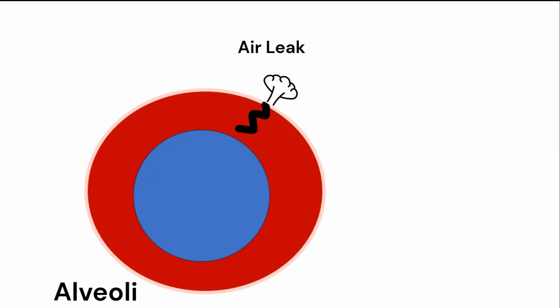The gas pattern is also useful in patients with air leaks. Since the high-speed gas stream is traveling through the center of the airway, it bypasses any areas of air leaks. This prevents gas from leaking out through the damaged area of the lung and allows the injured area to heal.